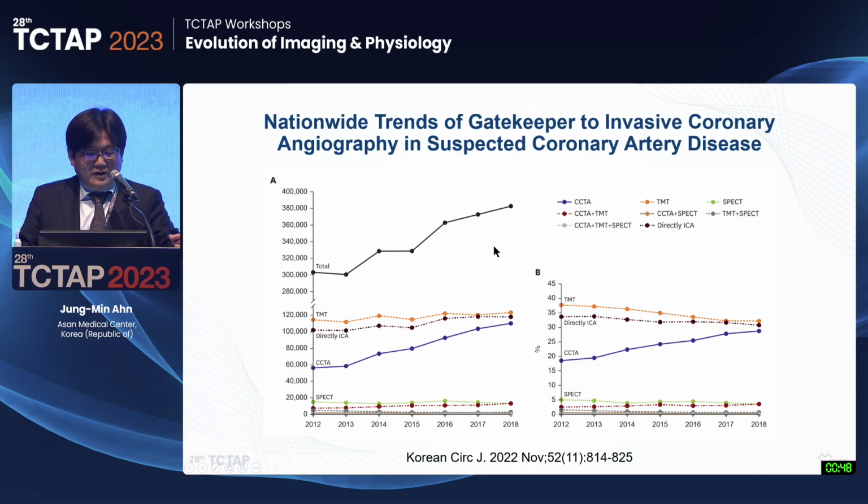one study evaluated what is done before coronary angiogram. The rate of stress testing is reduced, but CT coronary angiogram has significantly increased nowadays. So the total number of studies has increased, but mostly due to CT, not stress testing.